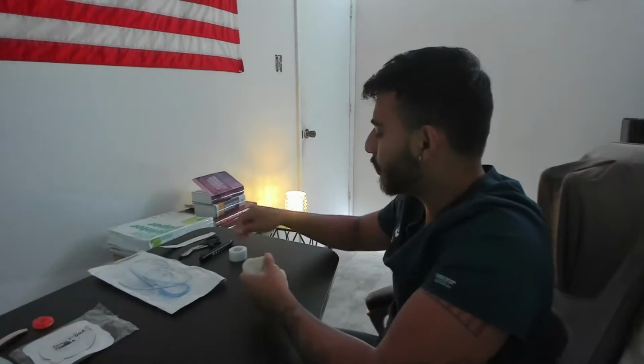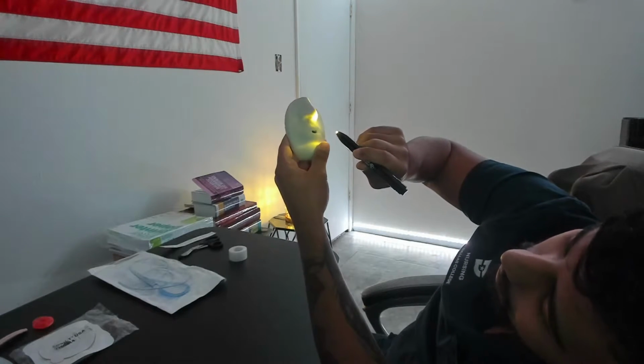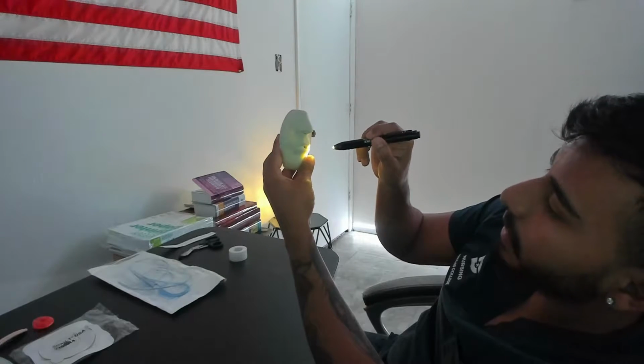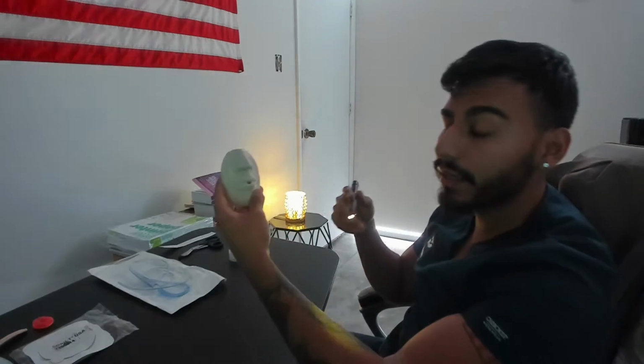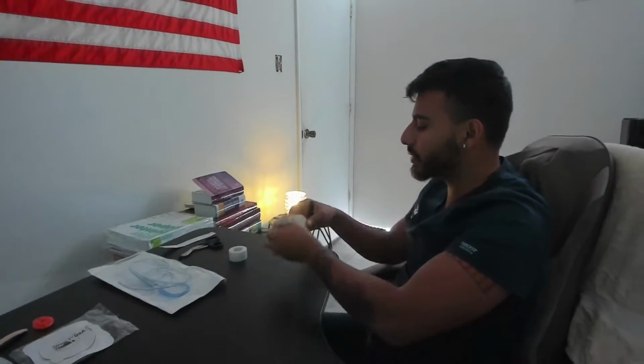Okay, and then I'm going to use my penlight to check for any polyps or lesions. While I'm here, I might as well check the oral cavity, look for any obstruction, anything that might cause complications in this procedure. So everything looks good. So now I can go ahead and prepare the patient's bedside.